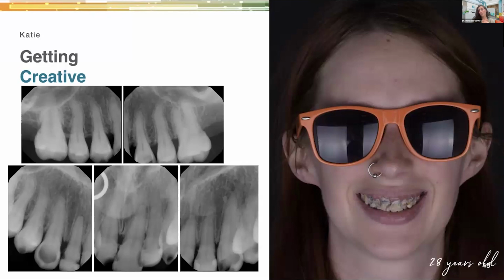And then we have a walkie system. So then they're going to walkie me saying crown is ready to deliver. I walk in, I put a little cement in there. Air abrade, bond, all the things, but I bond that on and then clean that up and I'm out, and they're taking a post-op image, checking the bite. If it needs adjusting, they'll call me back in.